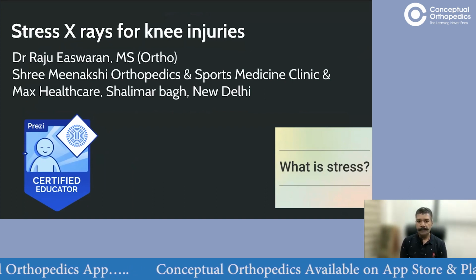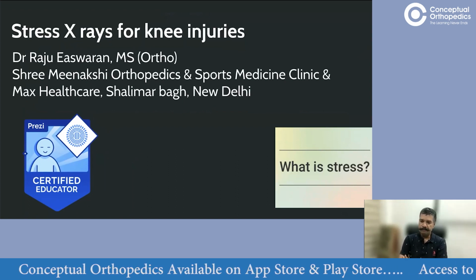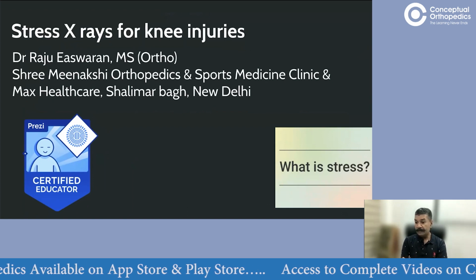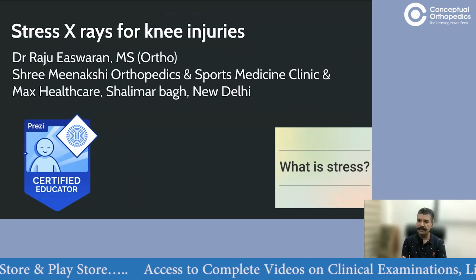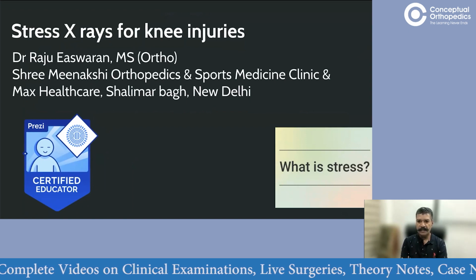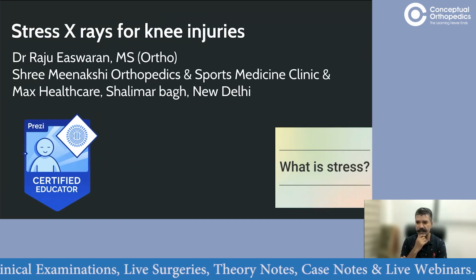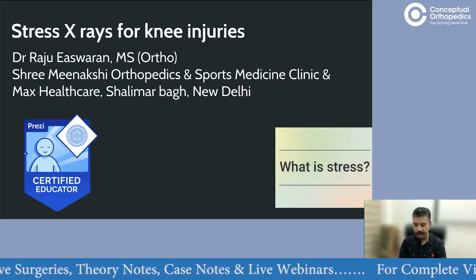Wonderful. So this is going to be a brief talk. So I would want it to be as interactive as you would like. And it will be interesting to know once we discuss this, how many of you actually get the stress X-rays done for various knee injuries in your practice. To be honest, I have only started this recently with the increase in multi-ligament injuries that is coming to us. And now multi-ligament knee injury is a routine practice.